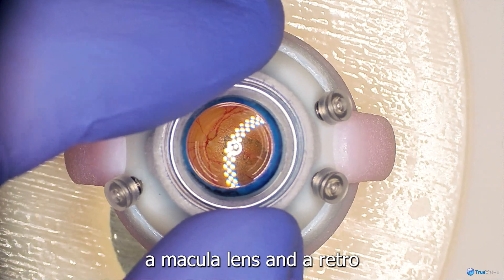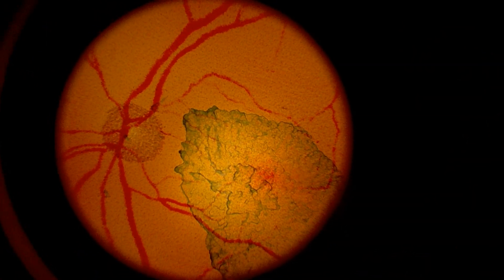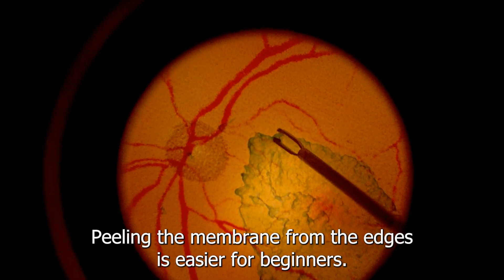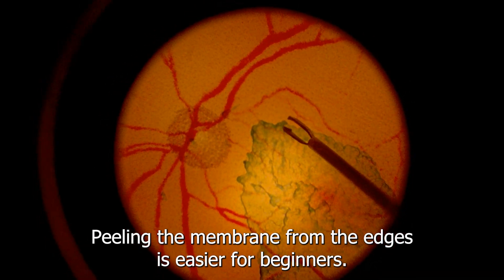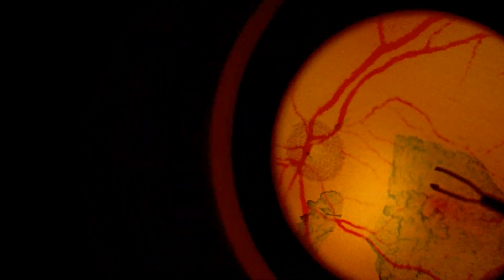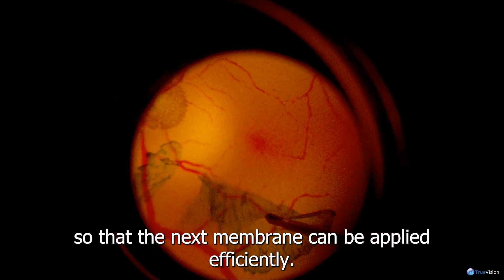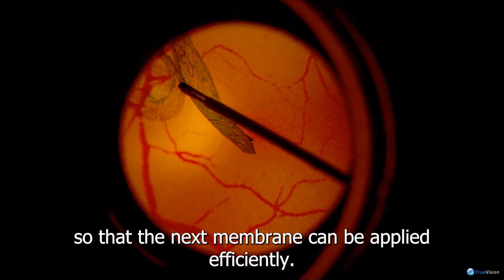A macula lens and a retro illuminated eye provide good visualization. Peeling the membrane from the edges is easier for beginners. Encourage the user to completely remove the membrane so that the next membrane can be applied efficiently.